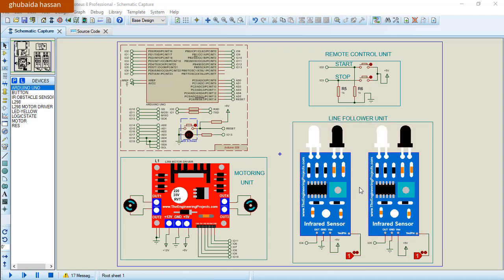As we know, IR sensors will produce a certain amount of voltage at their output pins after producing a light, and that light being reflected back to the receiver. So we'll have the transmitter LED and the receiver LED. This will transmit light, and let us assume the light falls onto a white color, and then it will be reflected back to the receiver. This will cause the IR module to produce some amount of voltage. So this will help us to make a line follow unit.